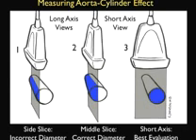The probe is positioned in a short axis orientation across the lumen of the aorta, and we can get a full sense of where the widest margins of the aorta are in order to place the calipers and get the best evaluation of the true measurement. So that's the cylinder effect, some of the pitfalls of measuring the aorta in the long axis configuration, and remember the short axis orientation will be the best way to truly measure the aorta.